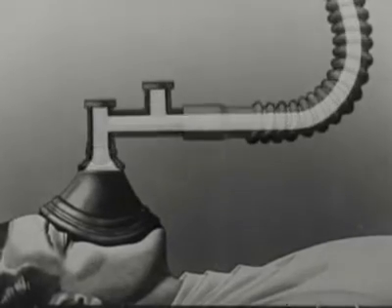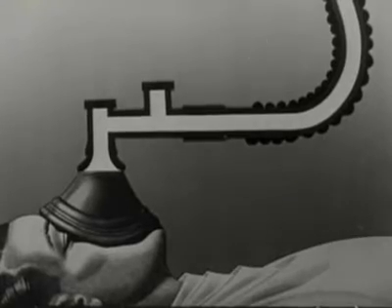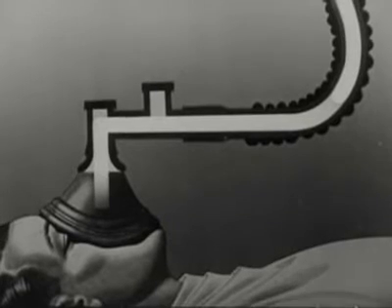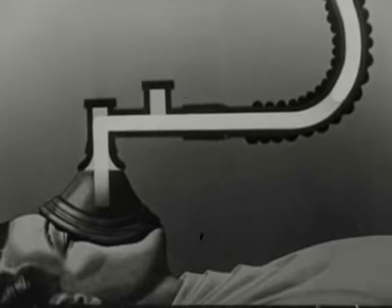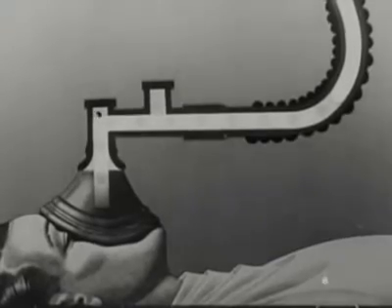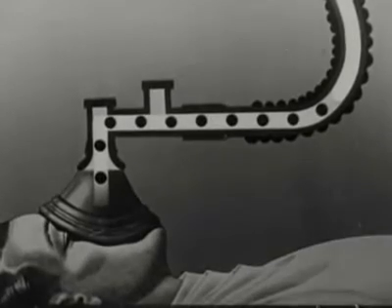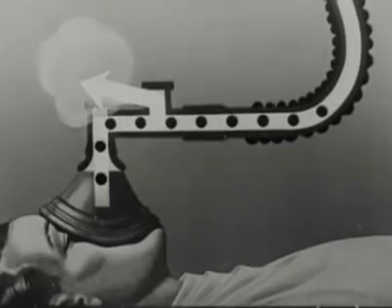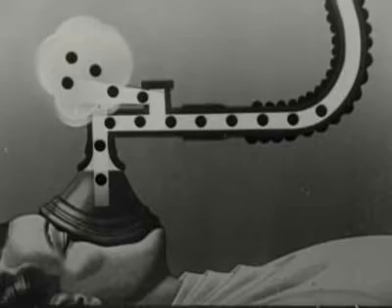When he exhales, the gases in the hose are forced back towards the bag, and the hose therefore contains fresh gases in the upper portion and expired gases in the lower portion. These expired gases contain carbon dioxide, which is represented by black dots. Once the bag is full, about halfway through expiration, the remaining exhaled gases pass out through the valve.